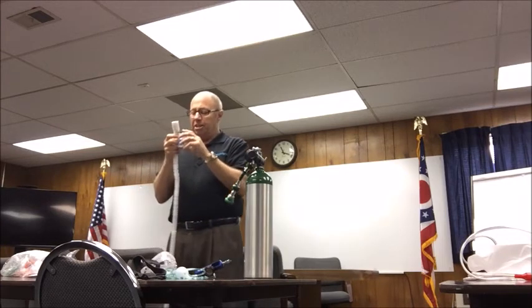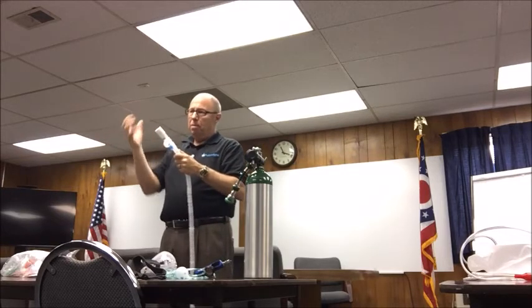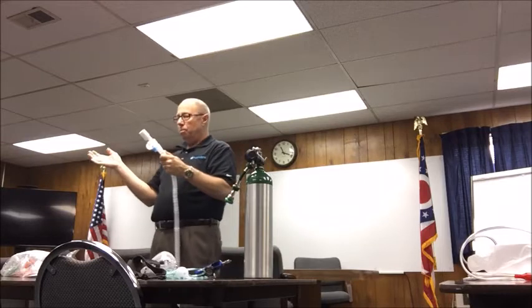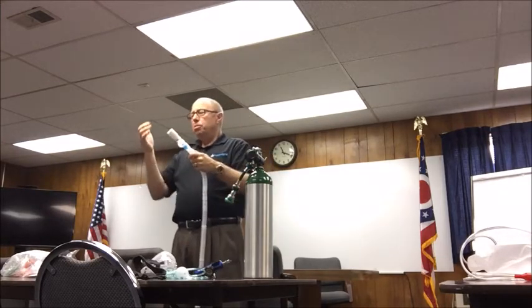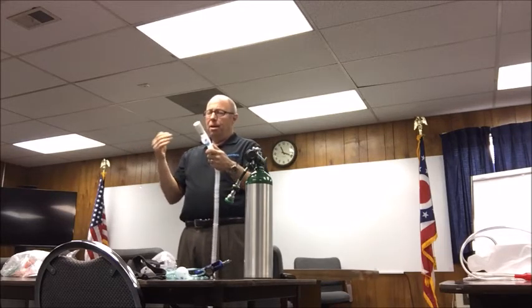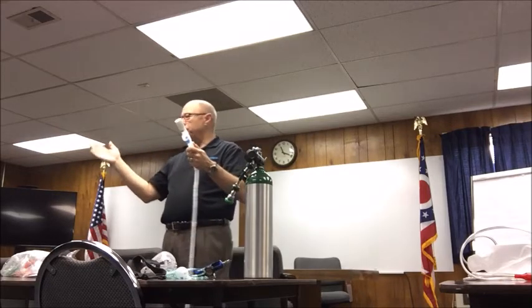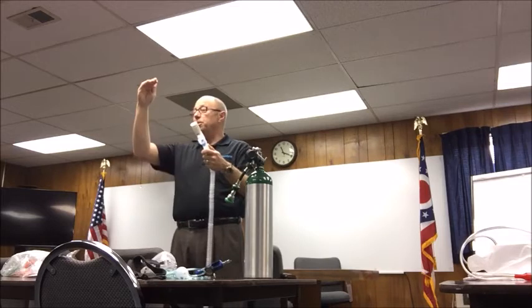Most of your patients, I'm a big believer in starting low and working up. The literature suggests that when people are in crisis, CHF, their PEEP pressure drops about 2.5. As we sit in this room right now, our PEEP is about 5. So if you have that patient at 2.5 and you hit them with 10, that's like giving 10 milligrams of morphine if 5 is going to work. Start low and work your way up because it gives you a place to go.